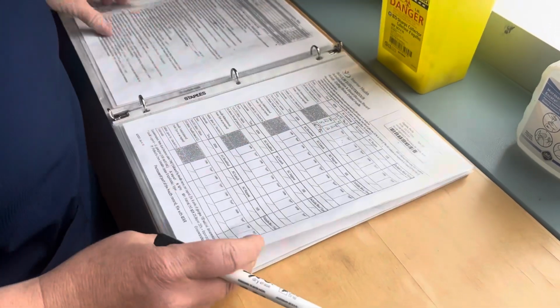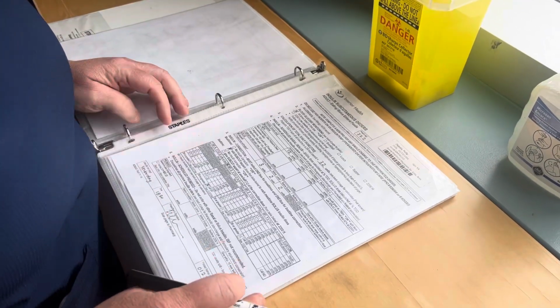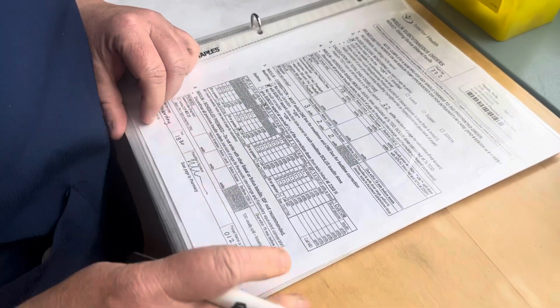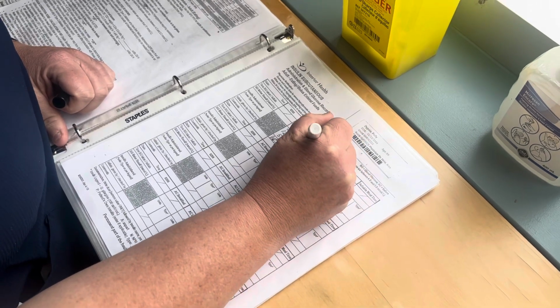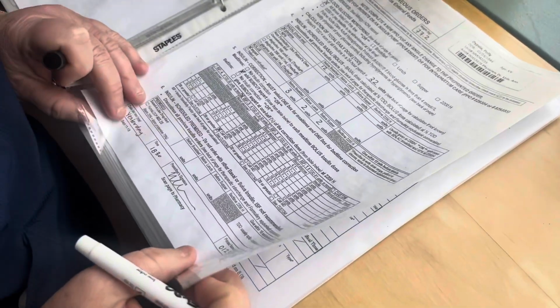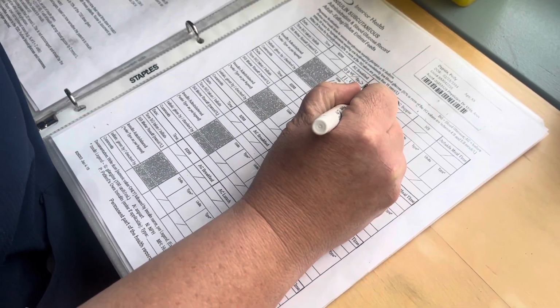Regular lunchtime dose is 2 units of aspart, but I did just take her blood glucose and it's sitting at 9.1, so that's using the ISF correction factor. We're going to have to add a unit, so she's going to get 3 units of aspart. Again, her blood glucose that I just took at noon was 9.1. Like I said, we're going to do 2 + 1, so we're going to be giving 3 units of the aspart.